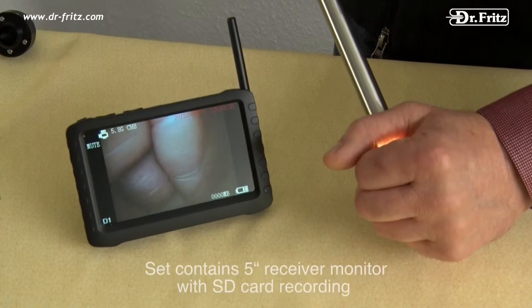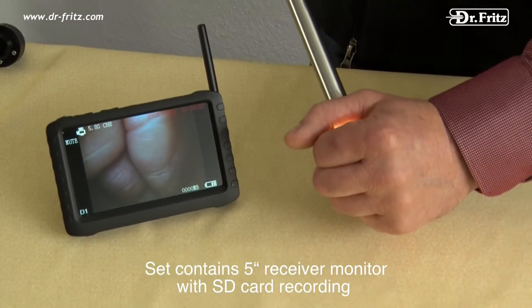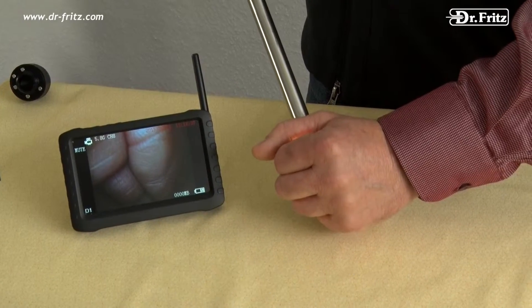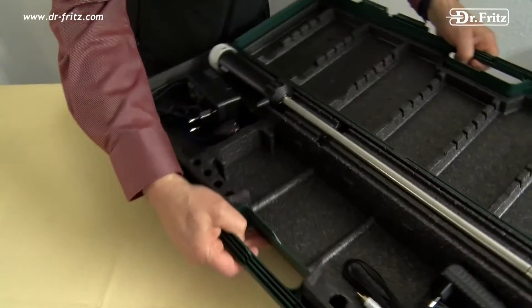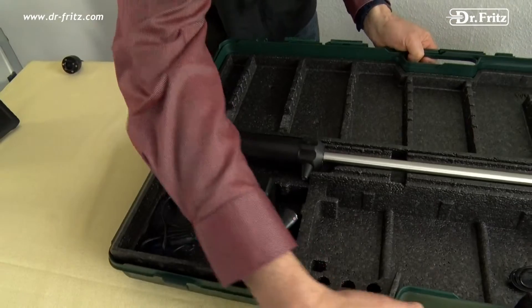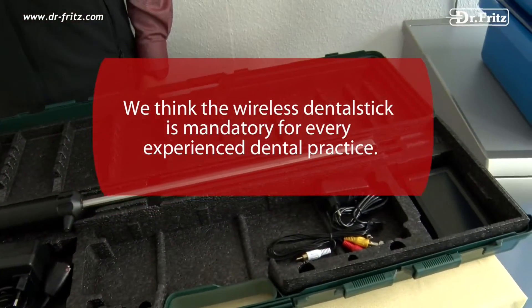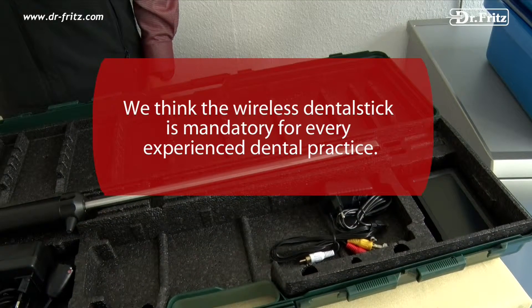The set contains a 5-inch receiver monitor with SD card recording, perfect for field practice. A transportation storage case with washable foam insert and a charger are also part of the set. The wireless dental stick is mandatory for the experienced dental practice.